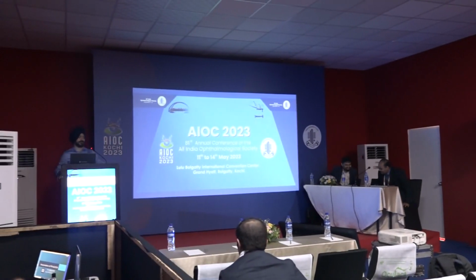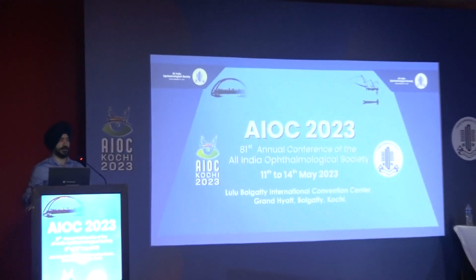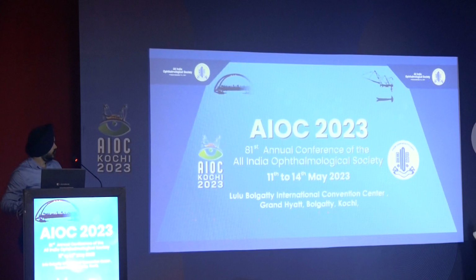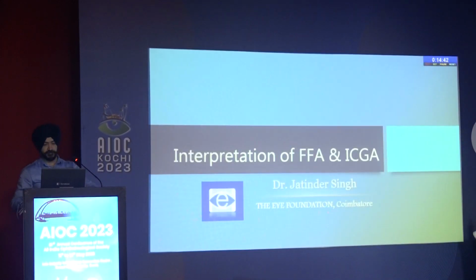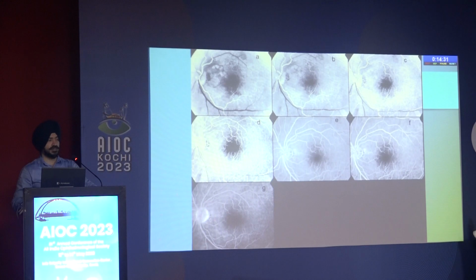We heard two excellent talks, and I'm going to talk on something which is probably a dying art. What Buckle has seen in surgery is probably what FFA is facing in the era of OCTA. This talk is going to be very basic, and I hope the PGs and fellows learn something from it.